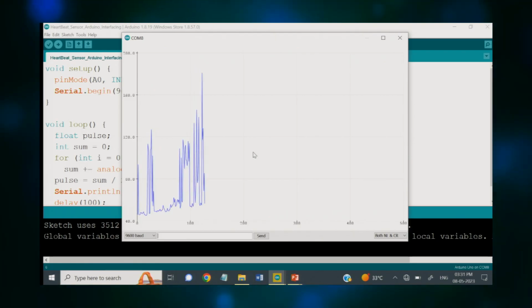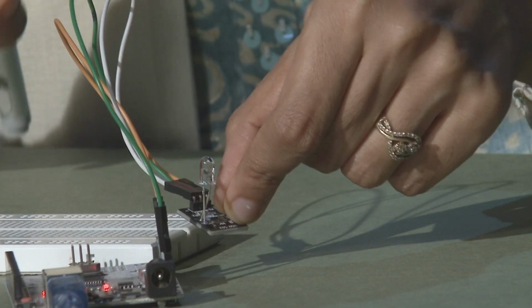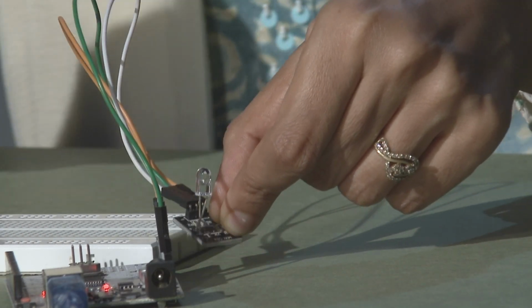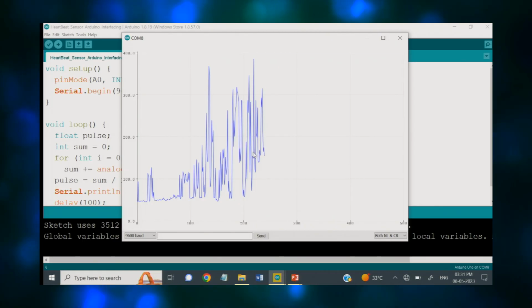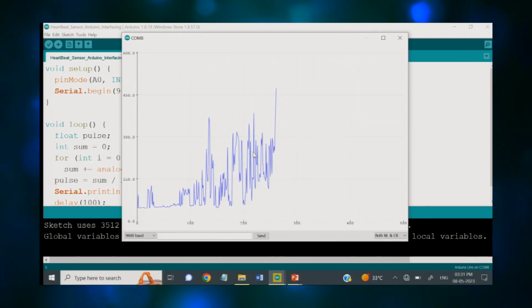So, as you keep on using it, you will learn which is its centralized position, where it does not cause unwanted noise in the sequence, and accordingly you can see a sequence of pulses being plotted here. The similar type of sequences you usually see on the monitor of a doctor, but here we have created a similar sequence, and this type of information you can later use to design some wearable sensors or maybe some medical fitness testing sensors.